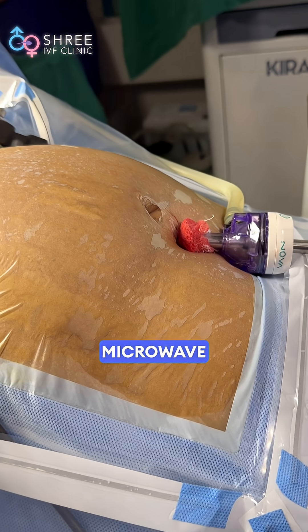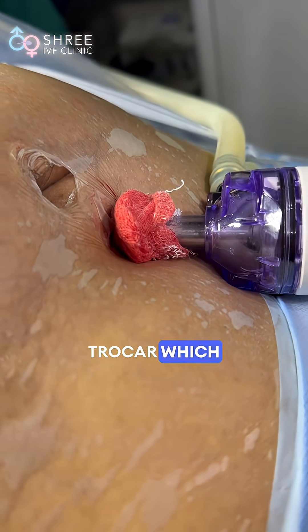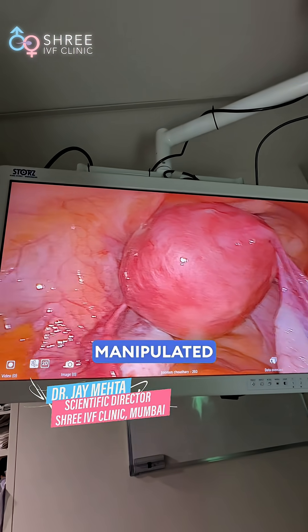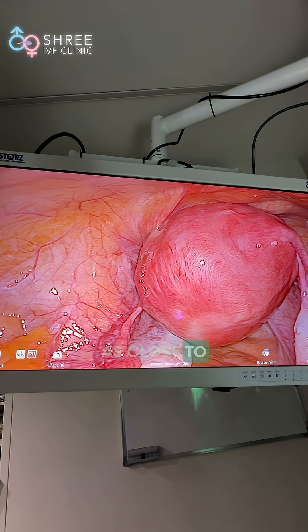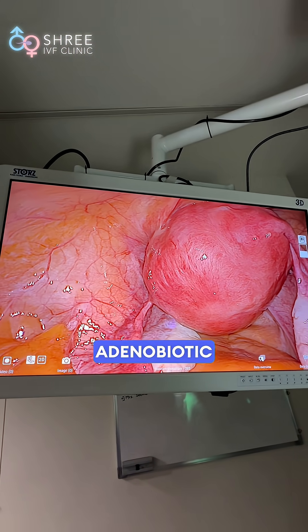This is a percutaneous technique for microwave ablation. The only trocar is the camera trocar, which is around 10mm in size. There is no other trocar in the entire abdomen. The uterus is manipulated from below — a vaginal manipulator is placed in the uterus to make sure the uterus comes as close to the anterior abdominal wall as possible. This is an adenomyotic uterus.